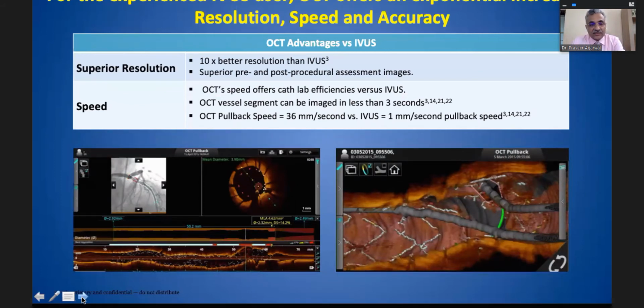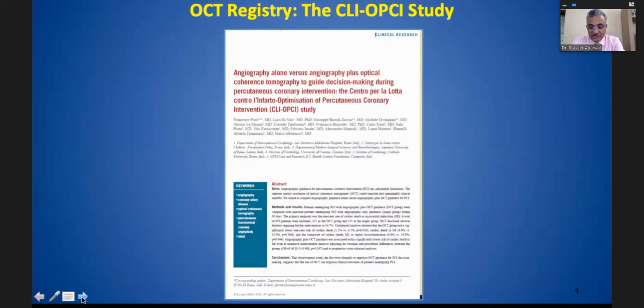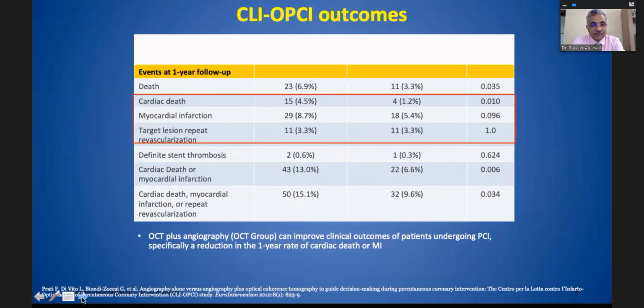The speed is tremendous. You can take about 36 millimeters per second. Robust clinical evidence, like we are not talking without evidence. Like CLI-OPCI, ILUMIEN I, II, and III, OPUS-CLASS, and the future trials like ILUMIEN IV, and other areas of consideration are complex procedures, DES and ACS. Let us see the detail of it. OCT, the CLI-OPCI registry, showed clearly that at 1 year of follow-up, if you're using OCT imaging during PCI, you are having better outcomes in terms of cardiac death, MI, and repeat revascularization. The numbers are not great, but still it is significant, about 15.1% as compared to 9.6%. There is not a great difference, but still the trends are really good. So they showed clearly that if you're using the device, you are benefiting the patient.